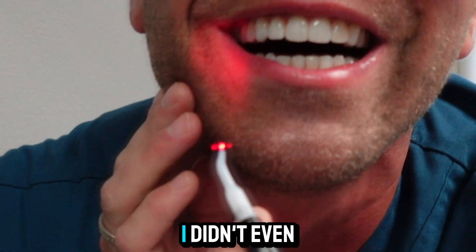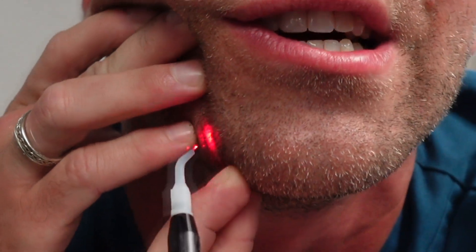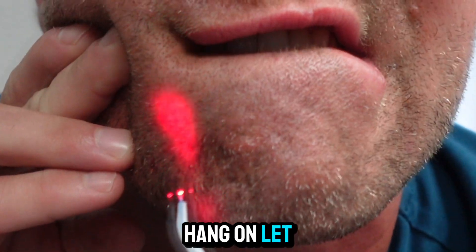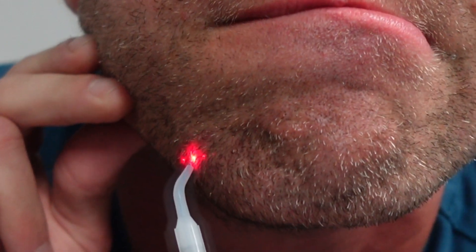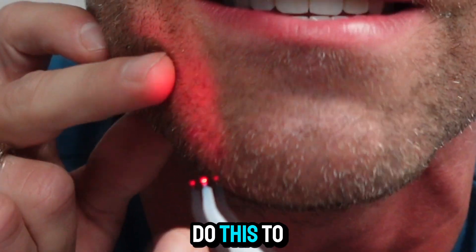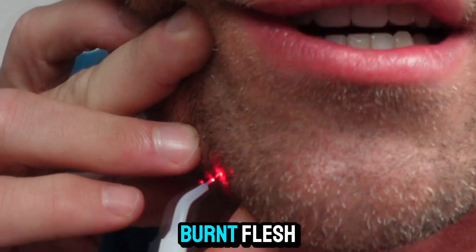I'm nervous. I didn't even touch it and it hurt. We'll try again. I need to get where I can see. Here we go — ouch. I don't know if I can do this to myself. You can smell it — it smells like burnt flesh.